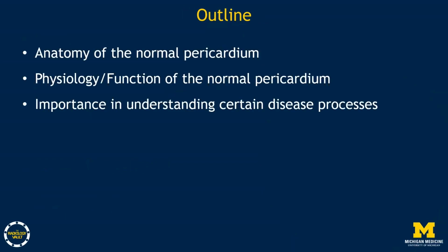In this short presentation I will discuss anatomy of normal pericardium and how it appears on cross-sectional imaging, physiology and function of normal pericardium, and will briefly go over why this is important to understand certain disease processes.